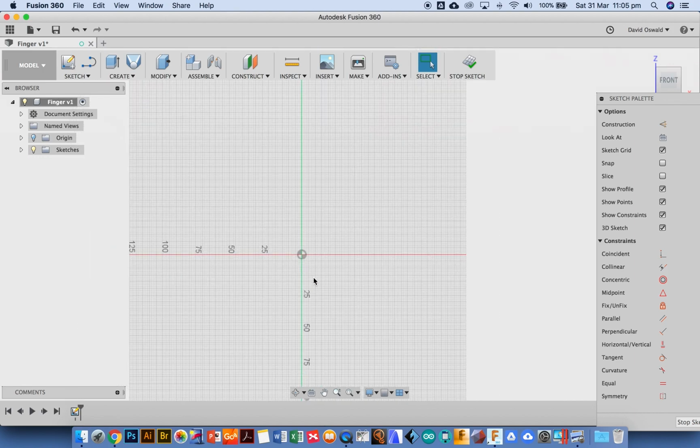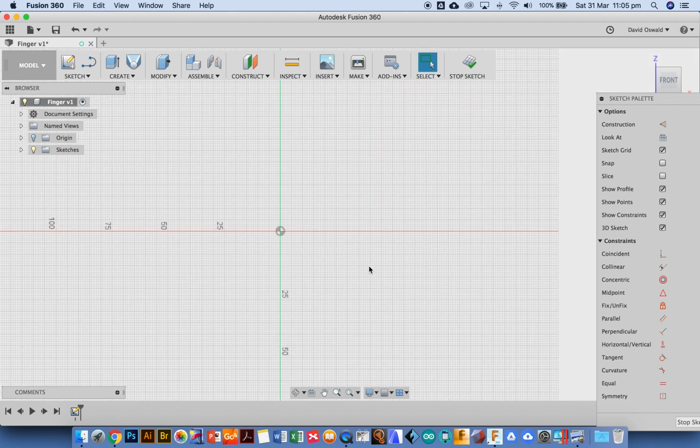Now all I'm going to do, this is good modeling practice and it's good for animation or controlling the shape of something. If I control the lines in the middle of the circles on one sketch and then add the circles on another one, it gives me much more control over that finger. So I'm just going to go line. I'm going to draw a line. Before I touch anything else, I'm going to go 40. Then I'm going to go tab. I'm sort of looking at maybe an angle of 45. And I'm going to enter.